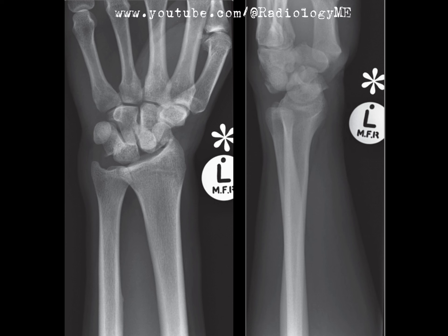Let's dive into this wrist case. Looking at the dorsi-palmar and lateral radiographs of the left wrist, the first thing that stands out is the alignment of the lunate. You'll notice that the lunate itself is sitting normally in relation to the radius. However, if we shift our attention to the capitate, there's something we don't like — it's been displaced dorsally.